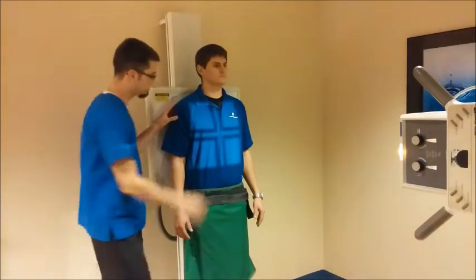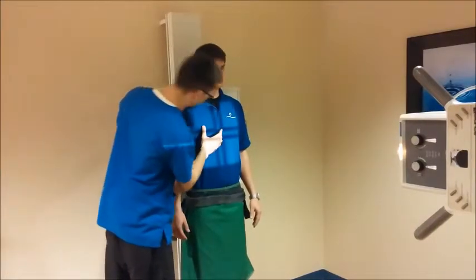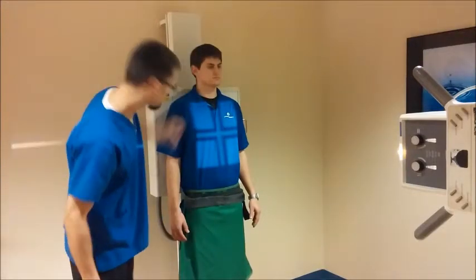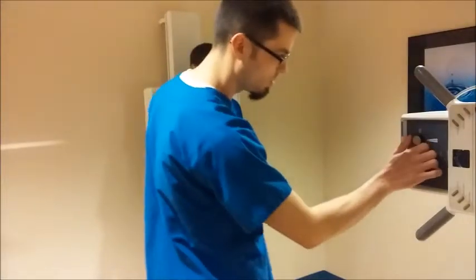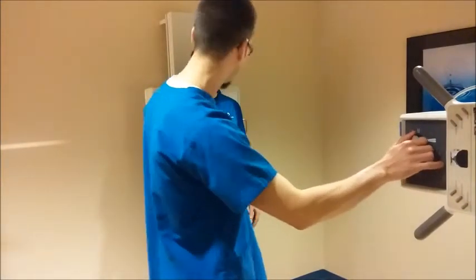For positioning, you'll want the central ray going right into the mid-sagittal plane, so I'm going to move you a little bit to the right. Okay. And good. And we're also going to want to collimate in side to side, probably about 4 inches or so.